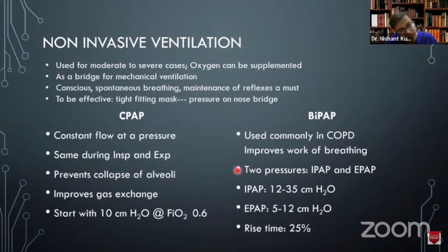Again, this is a bridge for mechanical ventilation. That means when you don't want to intubate or you don't want to tracheostomize, if the airway is patent, patient is conscious, continuously breathing, and reflexes are present, then you can use this and avoid mechanical ventilation to a certain extent.